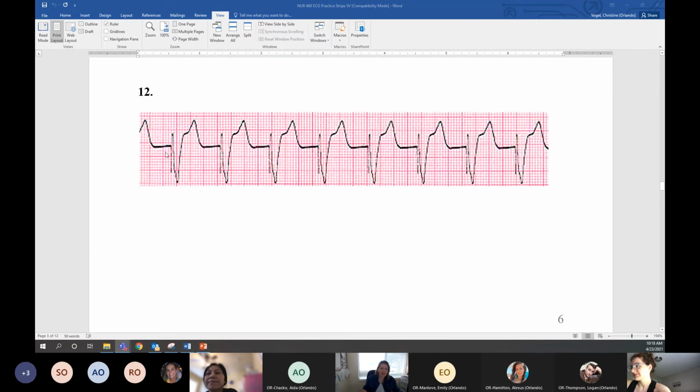Ventricular paced. Okay. And for even more detail, you know, there's 100% capture. So every time there's a spike here, we have a ventricular beat, okay? So this pacemaker is working very well for this patient.